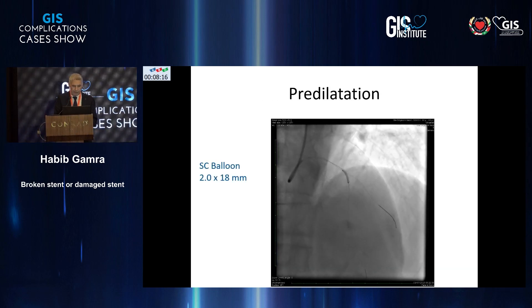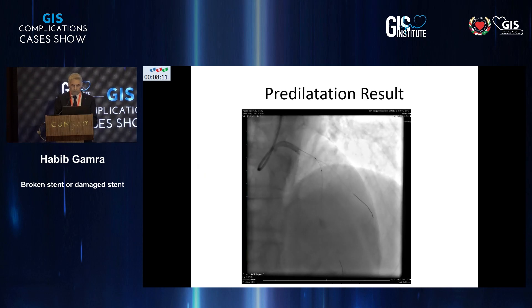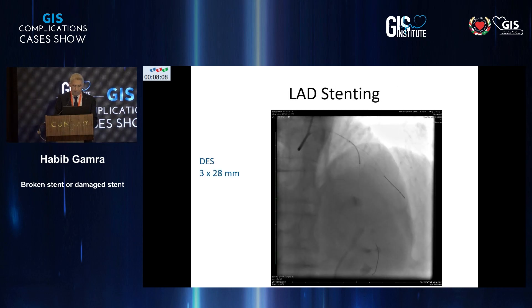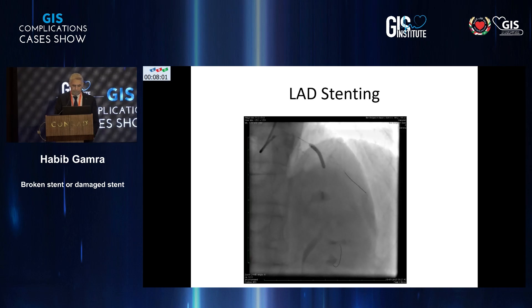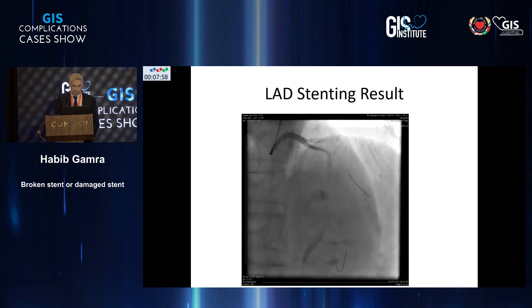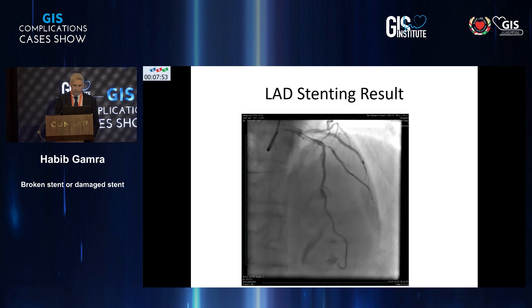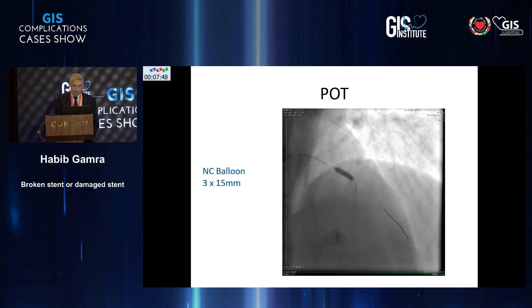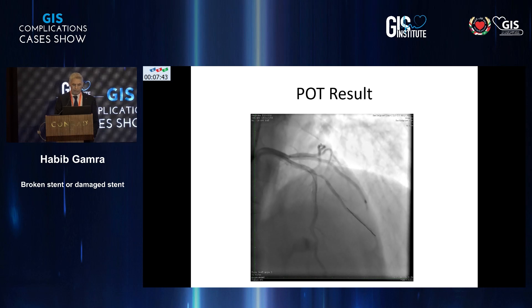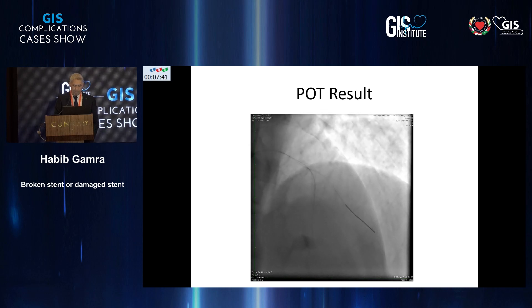Pre-dilation was done with a 2 by 18-millimeter balloon. This is the result. Then LAD stenting was done with a long stent, 3 by 28. You can see plaque shifting into the diagonal, so POT was done with an NC balloon, 3 by 15 millimeters. This is the result after the POT procedure.